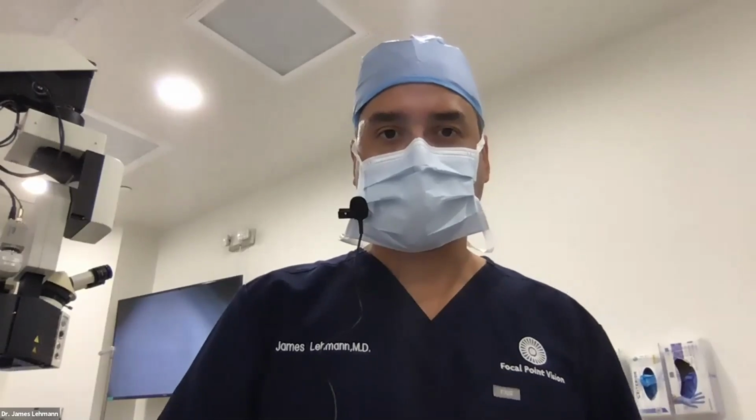Dr. Lehmann, they have some questions for you. I was just commenting on how nicely you had lens disassembly and movement inside the eye. And I think that was largely from both the fact that it was a white lens, but you took your time and got the pieces lined up. So thank you so much. Those were two beautiful demonstrations. You made them look easy. And certainly it was nice to see how you can always do divide and conquer, even in the most challenging of cases. So yes, Dr.